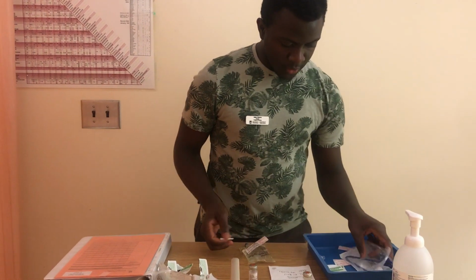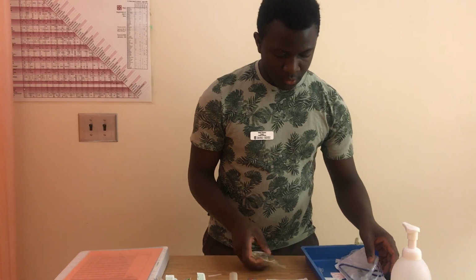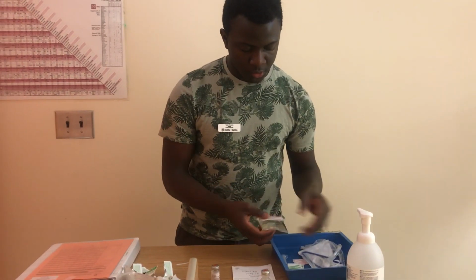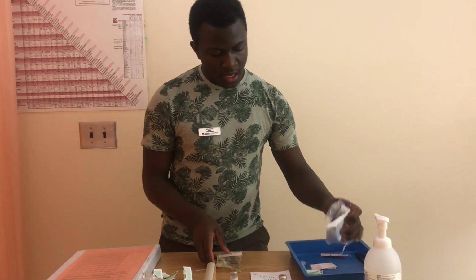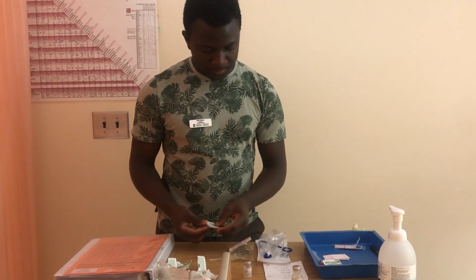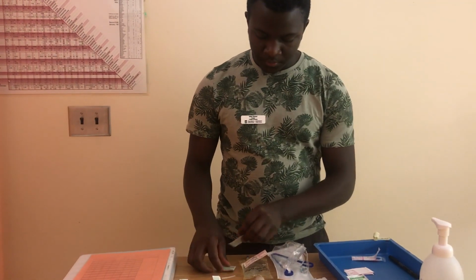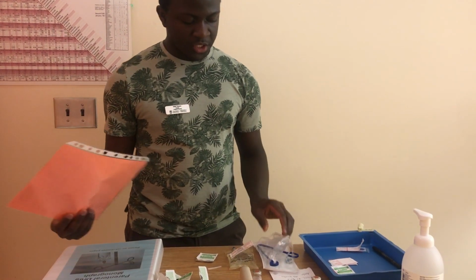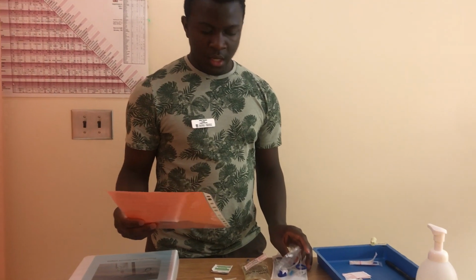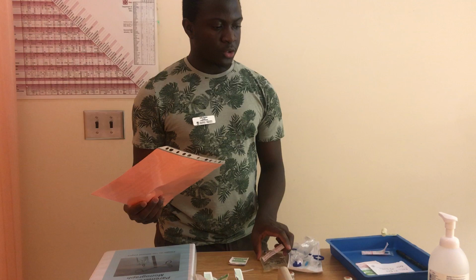I have my label here, and it will be given every 4 hours, so which will be after. So looking at the patient's chart, I will be getting everything I need ready to administer the medication in the patient's room. I have my medication, I have my tubing here, hydrocortisone, I'll need an alcohol swab, I need a 10 ml syringe, and I'll need to label my tubing as well. I already have 1.2 ml. So I will go to the patient's room with my chart.